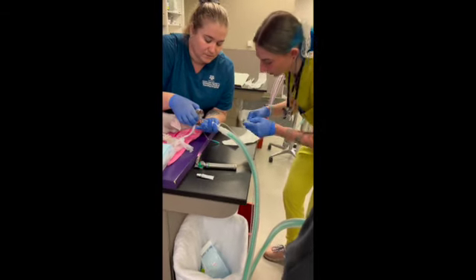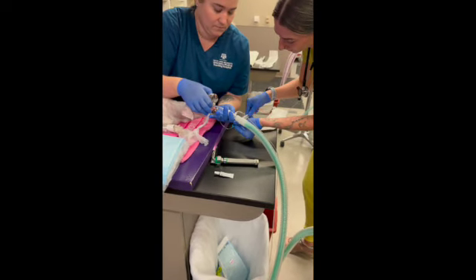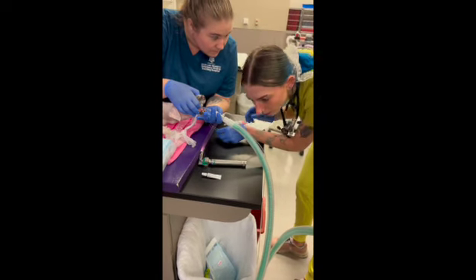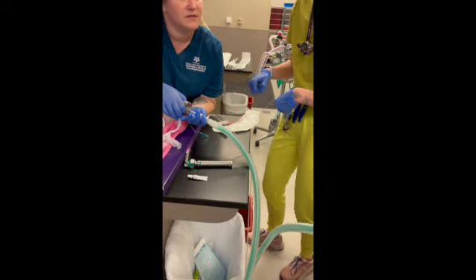I still hear a little bit of a leak. I might start with like a mil. A mil? That one sounded smaller. We're going to add another mil. I didn't hear anything. I do not hear anything either. Great. Okay, we can go ahead and start his gas at 2.